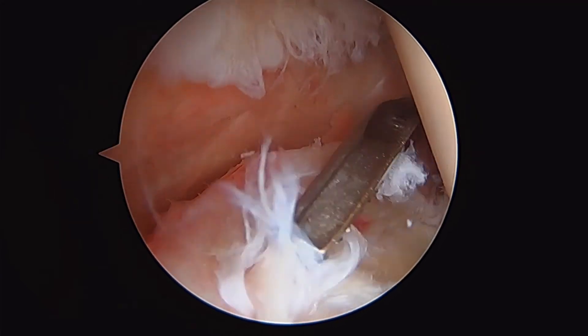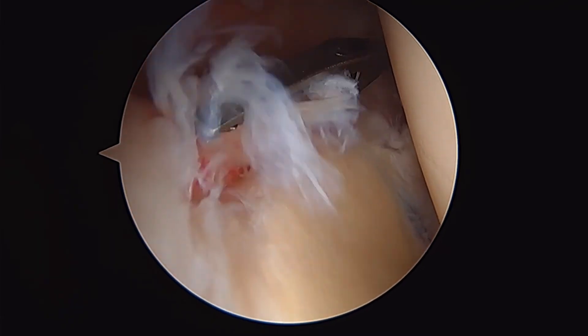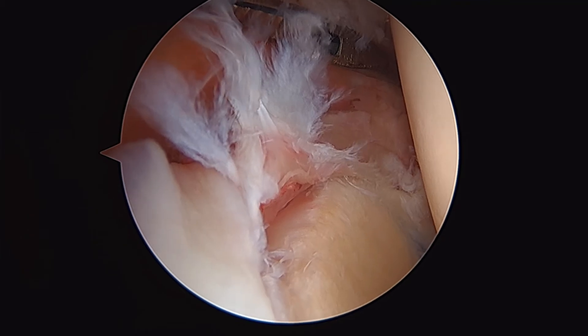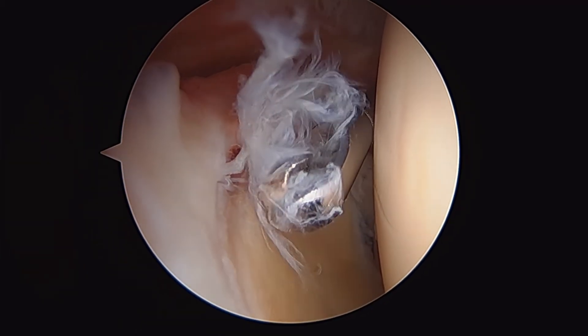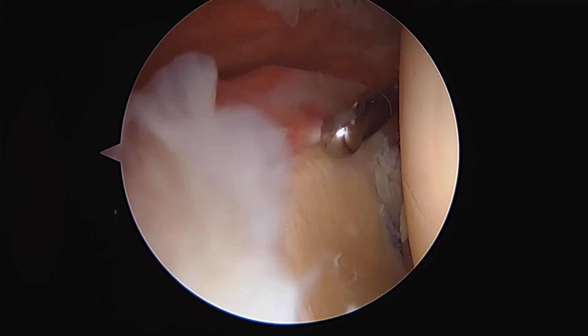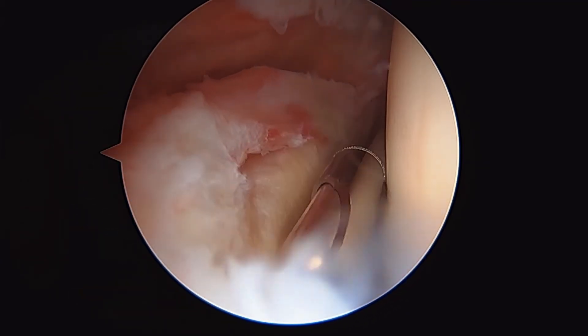Now you can perfectly see the superior labrum here and all this fraying. We'll clean this up, and then we're going to reattach his long-headed biceps tendon — that's called a biceps tenodesis. This is a type 2 SLAP tear of the shoulder. Here's our 3.5-millimeter shaver coming into the joint, and we're just cleaning up this frayed tissue here.